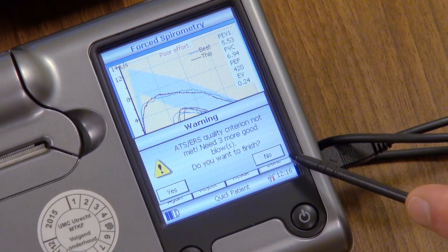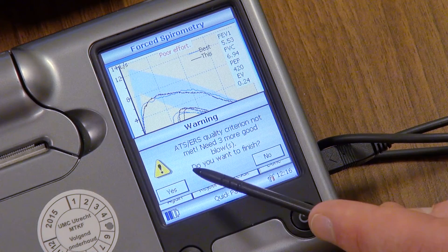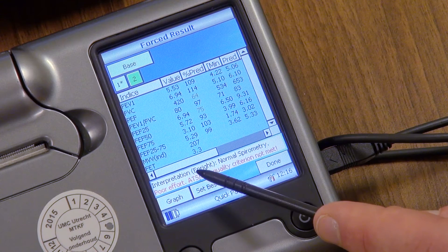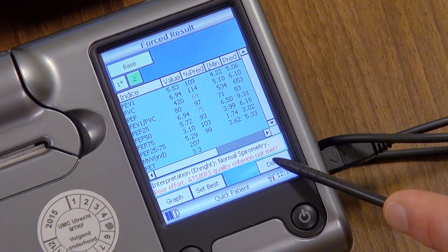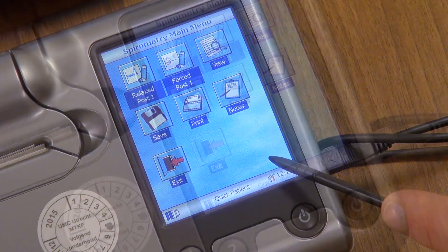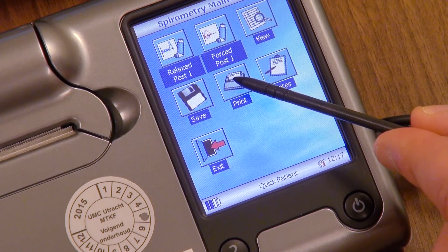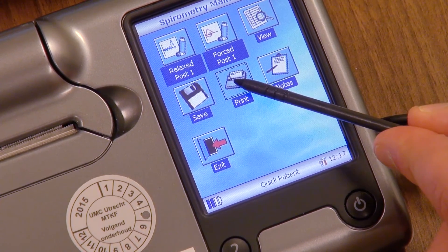This will prompt an error. If you press yes, you will be able to review your results again. To print the results of the tests, press print on the main screen of the device.